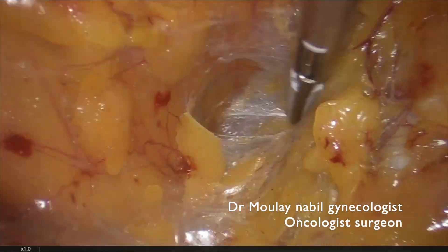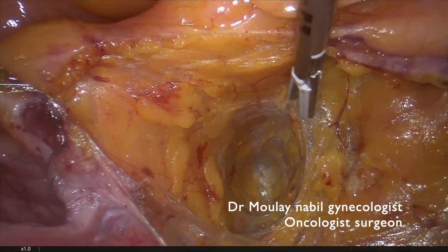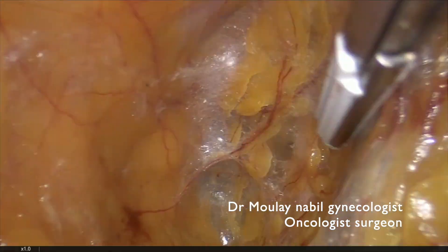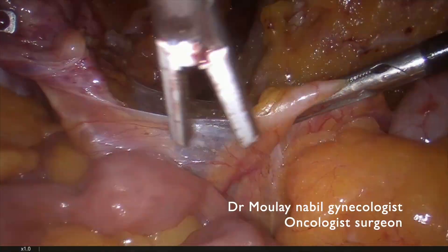We opened firstly the paravesical space. For that we pull in the obliterated umbilical artery and by a movement of traction and counter-traction our goal is firstly to reach the obturative artery.